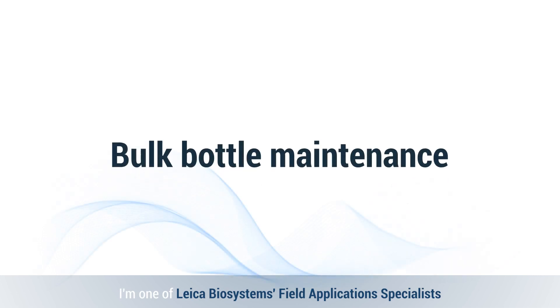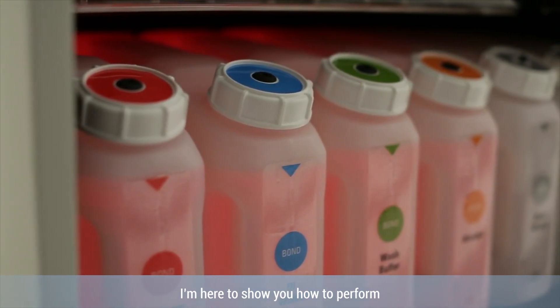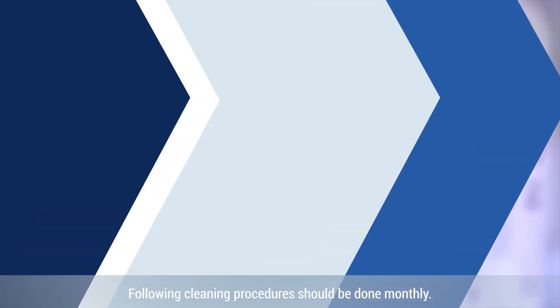Hello, I'm one of the Leica Biosystems field application specialists for advanced staining. I'm here to show you how to perform bulk maintenance on your bond system. The following cleaning procedures should be done monthly.